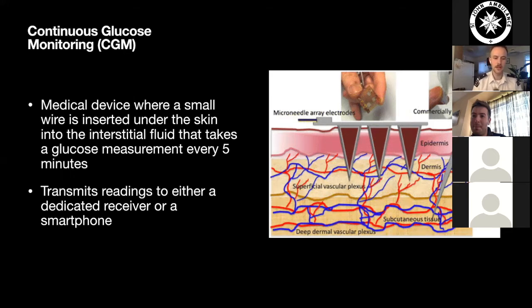I apologize if you can't read it too well on the screen here, but you can see my sugar was quite high today and I was out for a run, so I was pretty okay with it and let it come down. It's tracking nicely. That's the 6 units of insulin that I took with my dinner, and we're sitting at a nice 6.8 right now, which I'm not worried about. Similarly, if my blood sugar starts to go high, as when it was drifting high earlier, it sends me a little friendly alarm saying, hey, your blood sugar is a little high, you should do something about that. And when it starts to go low, it gives me a friendly little alarm letting me know, hey, I'm a little worried about you.